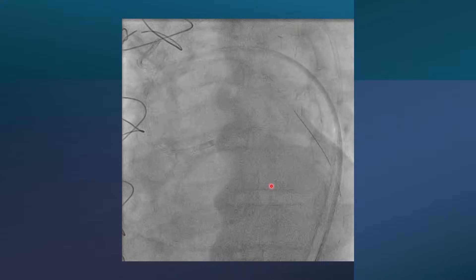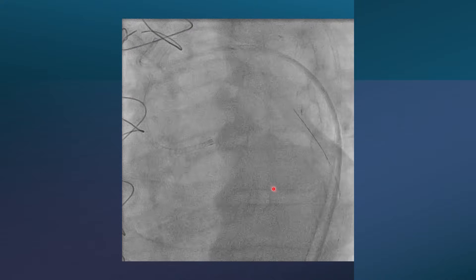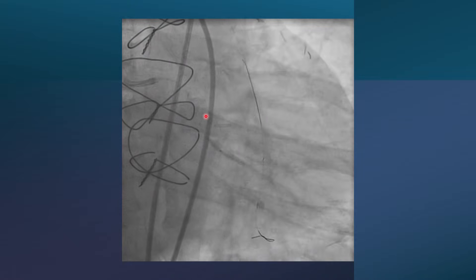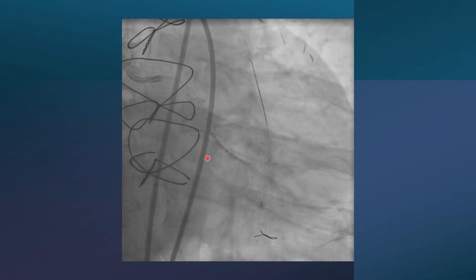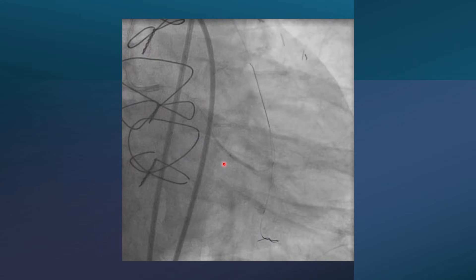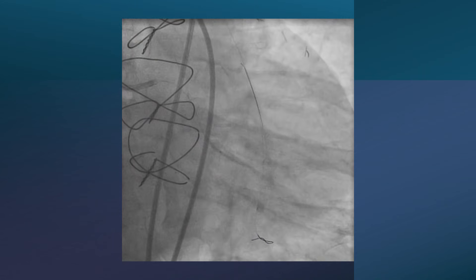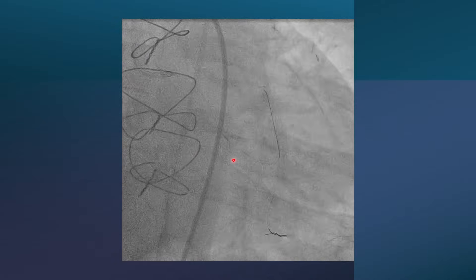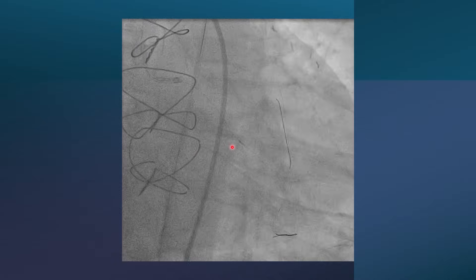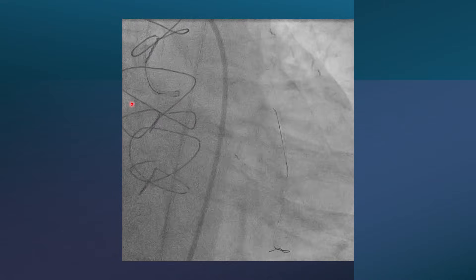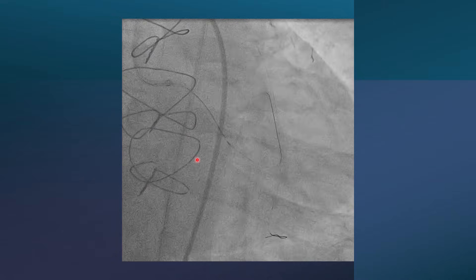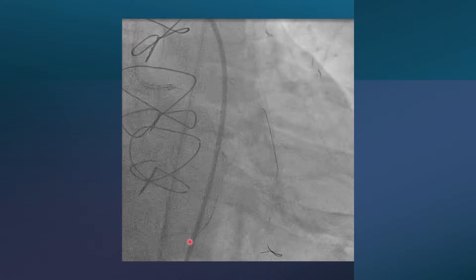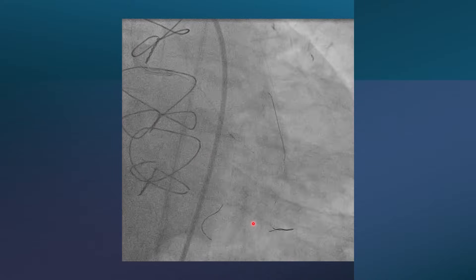The next challenge was directing the wire into the proper circumflex rather than only into the OM. After pre-dilation, it was not possible to do this without a dual-lumen microcatheter. Using the Sasuke dual-lumen microcatheter, we were able to direct a wire into the main branch of the circumflex.